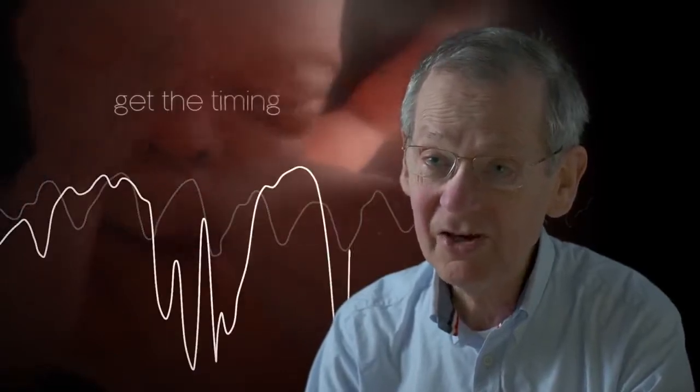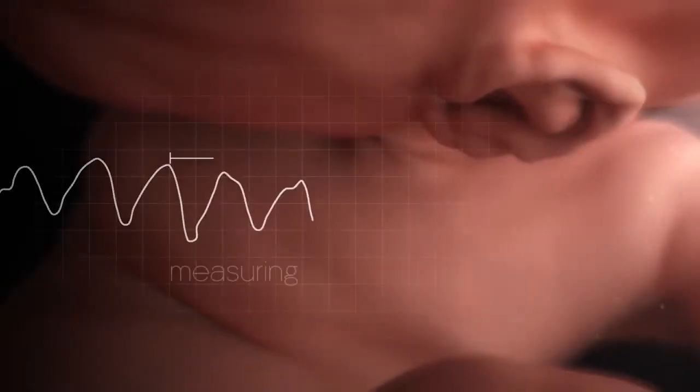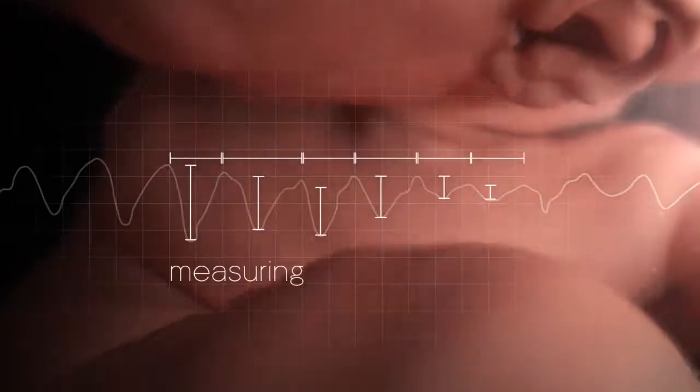I wanted to be able to monitor the progression from normality through to abnormality and get the timing of delivery right, and I realized that could best be done by measuring the quality of the patterns rather than by eyeballing them.